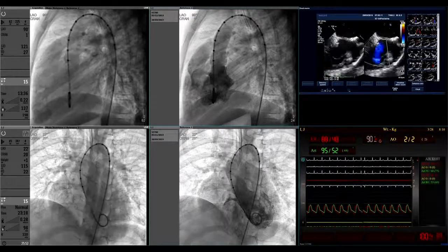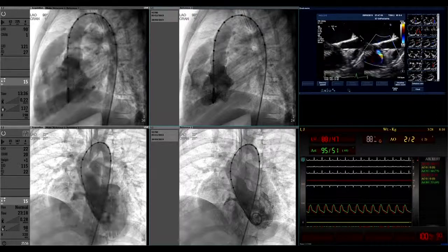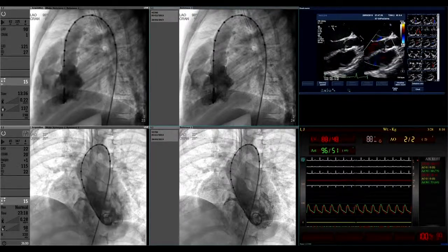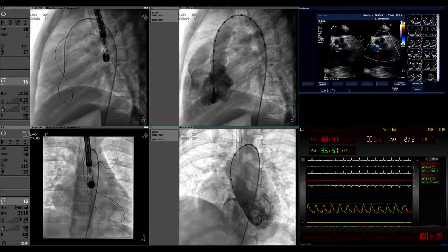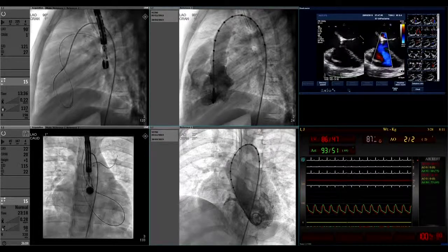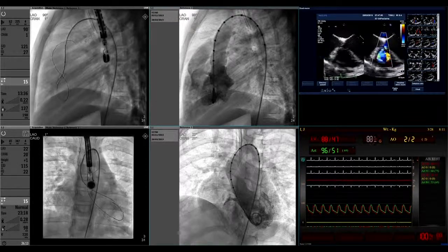Dr. Joe? Yes. We try to cross next. Yeah, the next. We try to cross the VSD. Then Dr. Joe has a comment. Not working. Maybe behind, Joey. There's another one in the back.